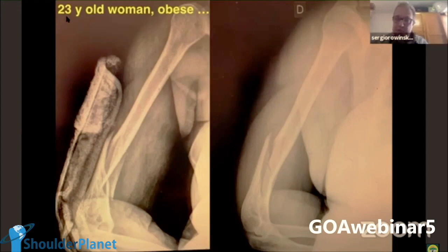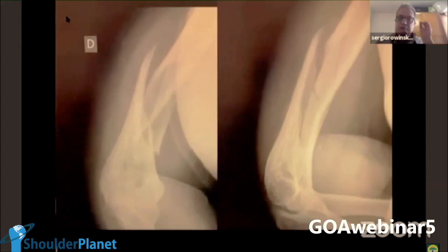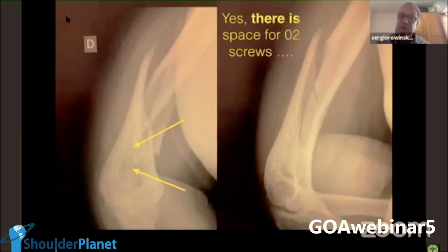It was a tragedy. And in obese patients, it's a mess. It's very difficult to control the varus, the valgus, and you have a lot of issues with elbow stiffness. So, as long as I can put two up and two down, I'm happy. It's enough. I have space for one here, I have space for two. And there is absolutely no place for any mistake.